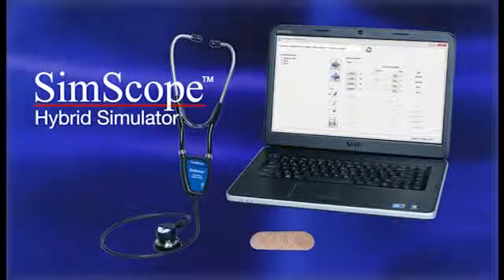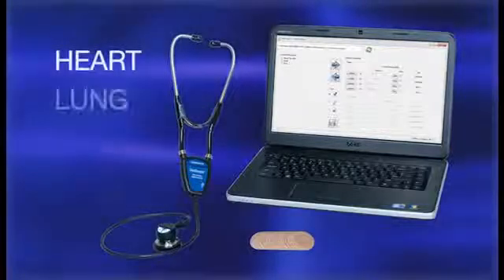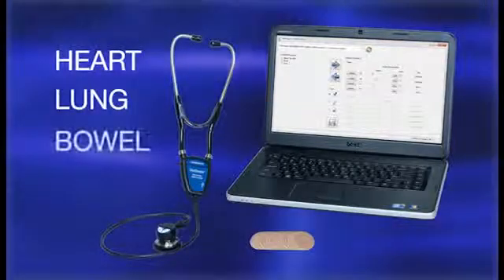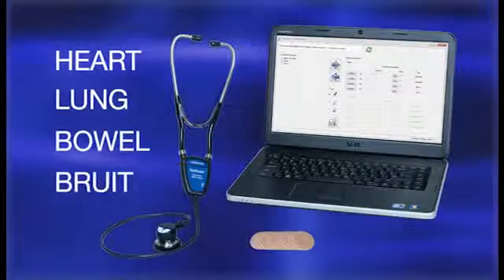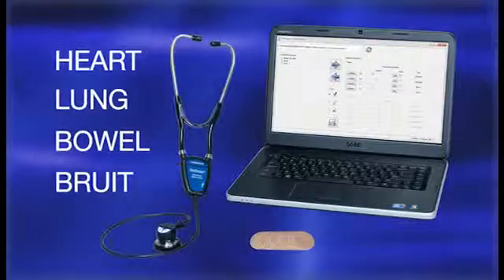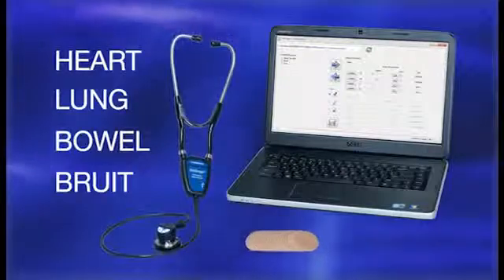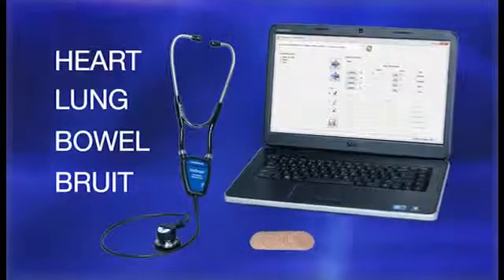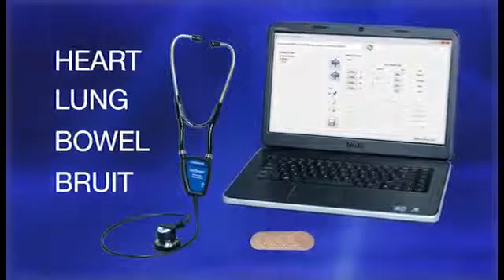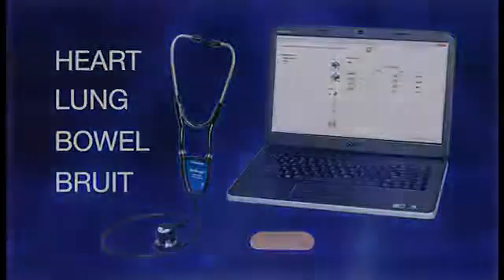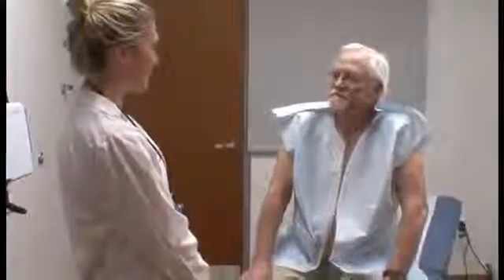The SimScope system simulates heart, lung, bowel, and bruit sounds utilizing the SimScope stethoscope, SimScope patches, and SimScope software. With simple one-on-one student-patient interaction, it is an ideal tool for use with any standardized patient and OSCE program.